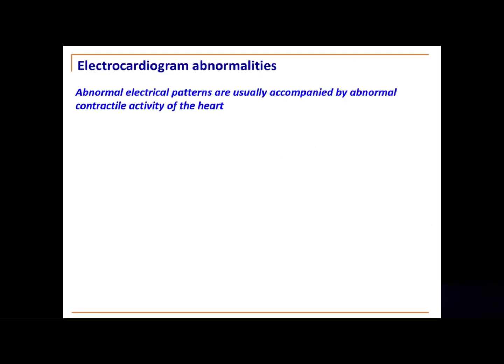So that is the ECG in health. If you can do those crude few things that we just talked about, thinking about the P wave, the QRS complex, the T wave, and then a couple of the little intervals, what's happening at each of those points, that is what you need to know at this point.